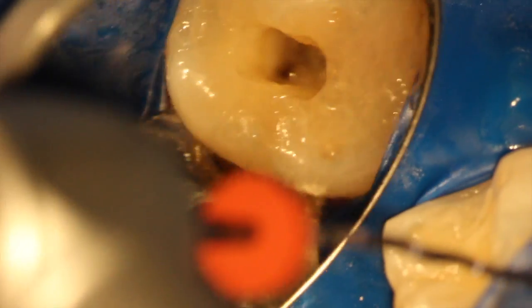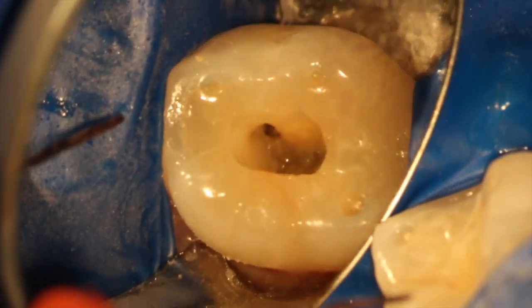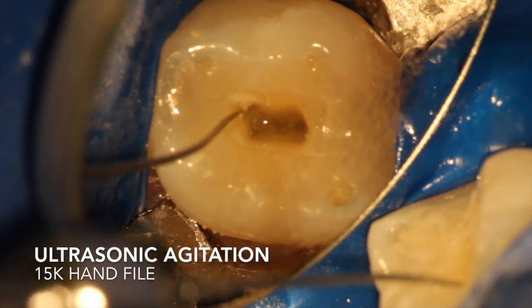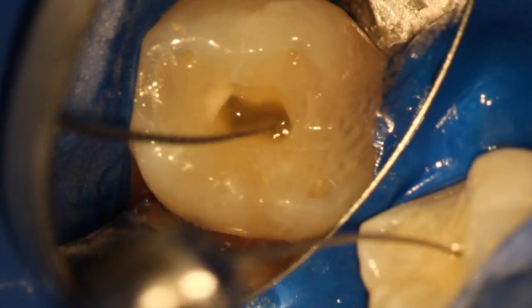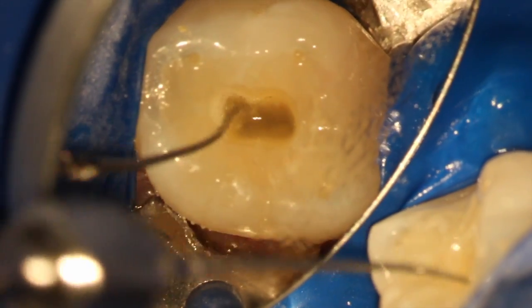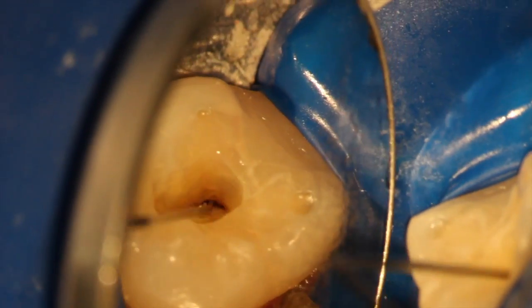I'll spare you the full shaping protocol — maybe in another video I'll go through that — but essentially keeping it at an 04 preparation, so it's not too tapered. The idea is to keep less taper and conservative shaping. Just take what the tooth gives you. At the end, we do some ultrasonic agitation with a 15K file on medium to low setting. Spend about a minute doing that.